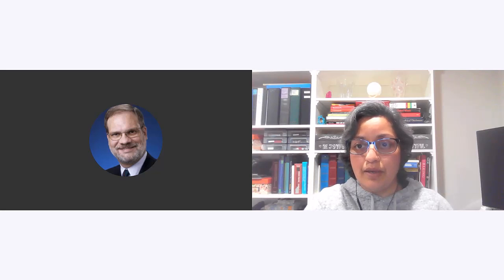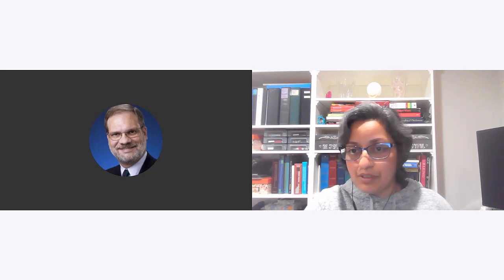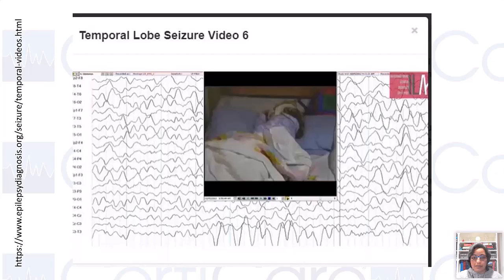All right. So in this video, the patient is sleeping and they wake up. They wake up and have impaired awareness. There is right arm dystonia, and you can see ictal changes on the left side.